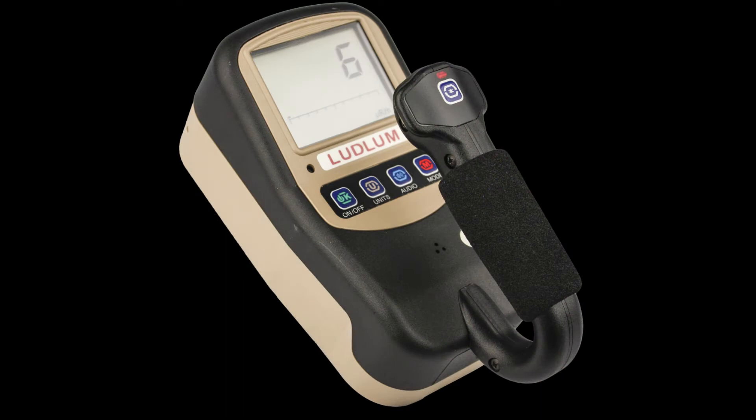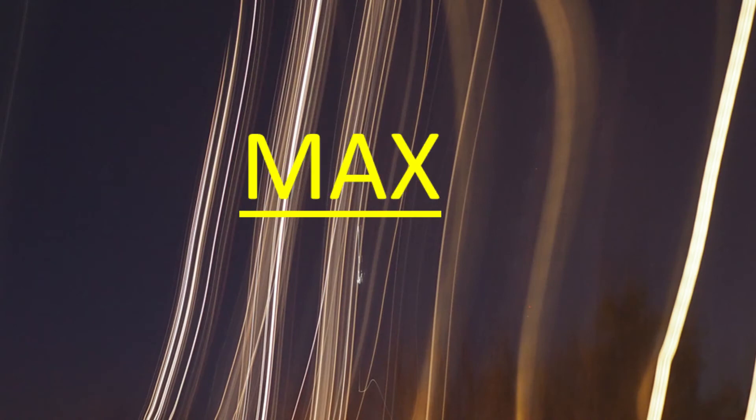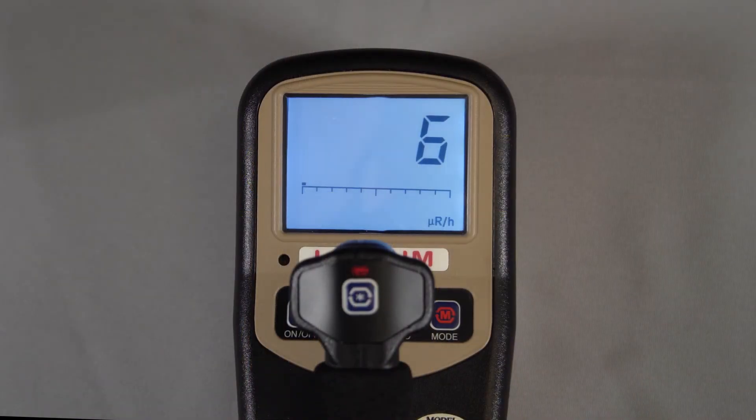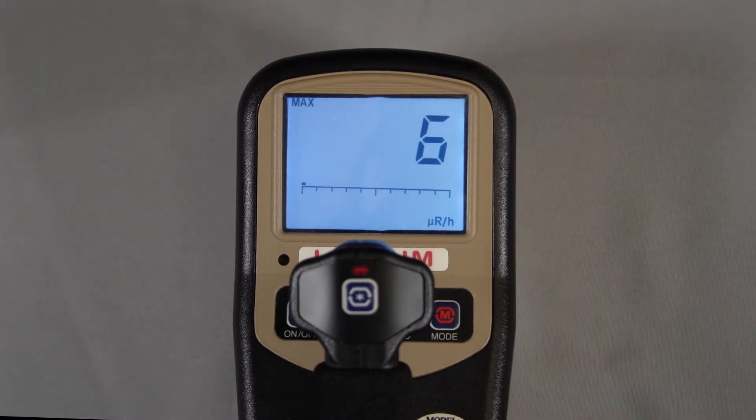There are three modes of operation available for the Model 3019. The rate mode will display the current exposure or dose rate. Max mode is used to capture the highest exposure or dose rate detected, useful for finding a peak rate when the display is not visible.